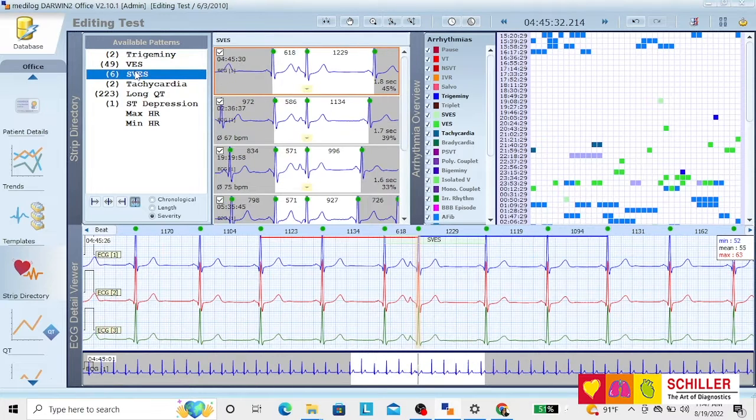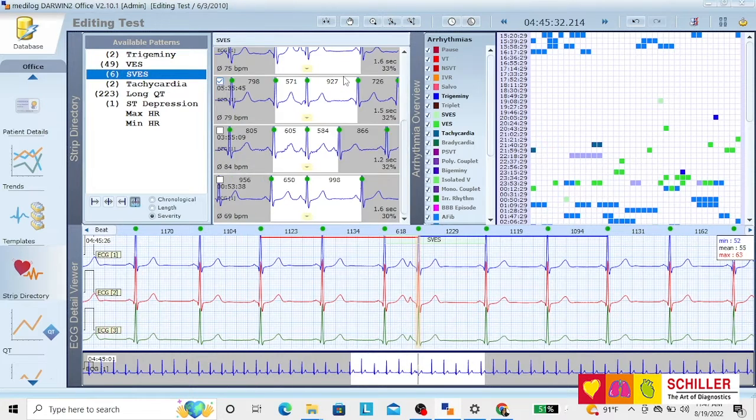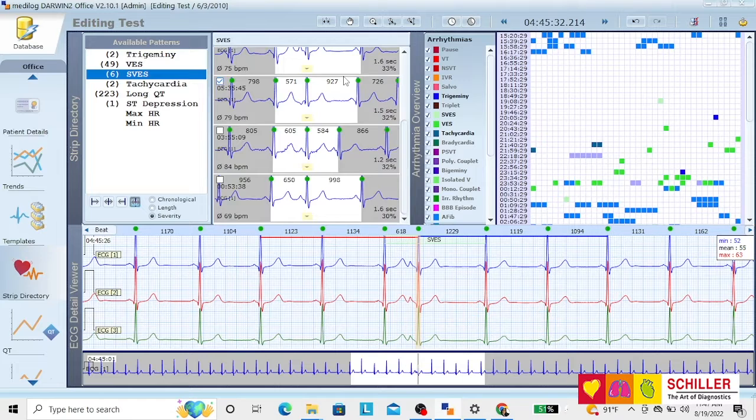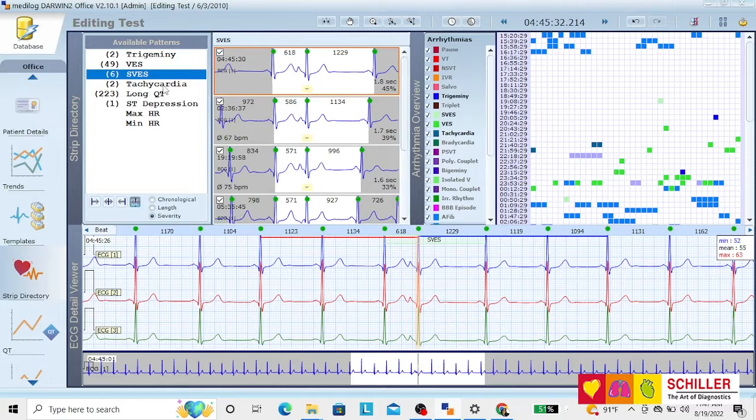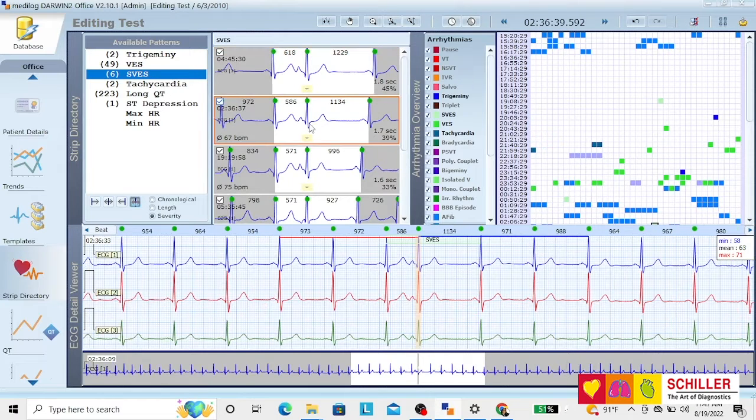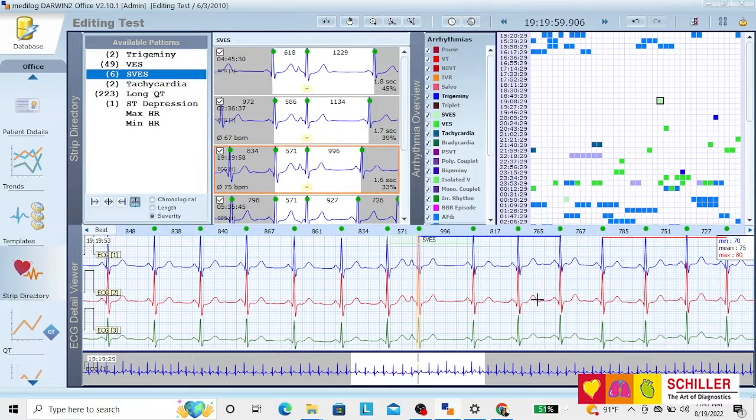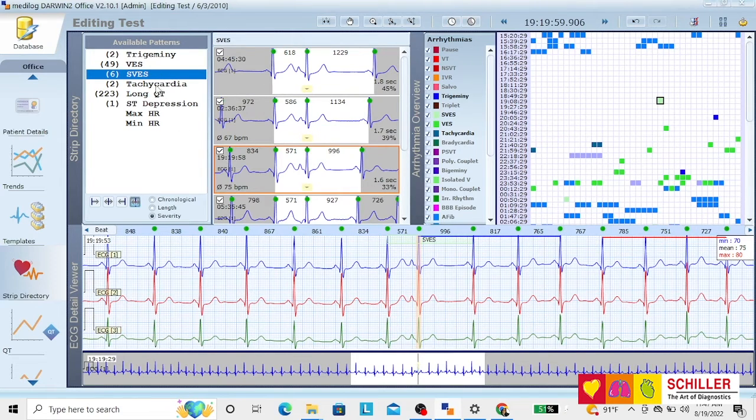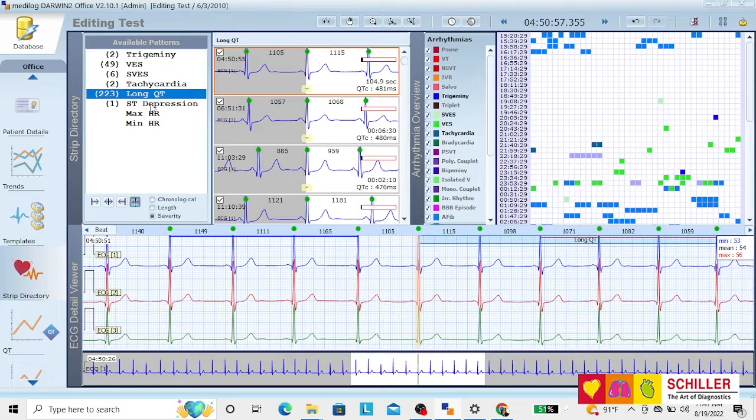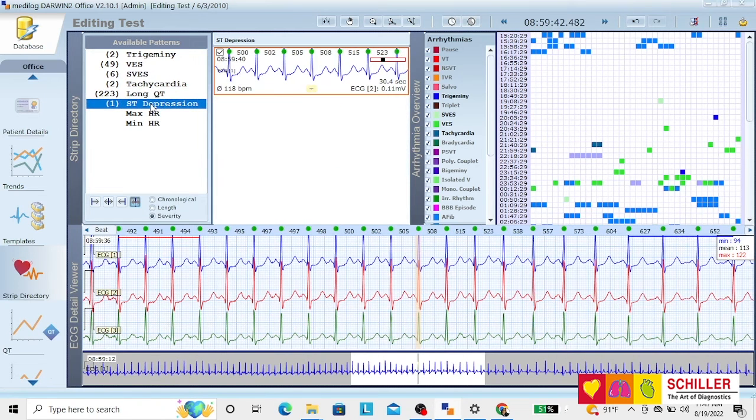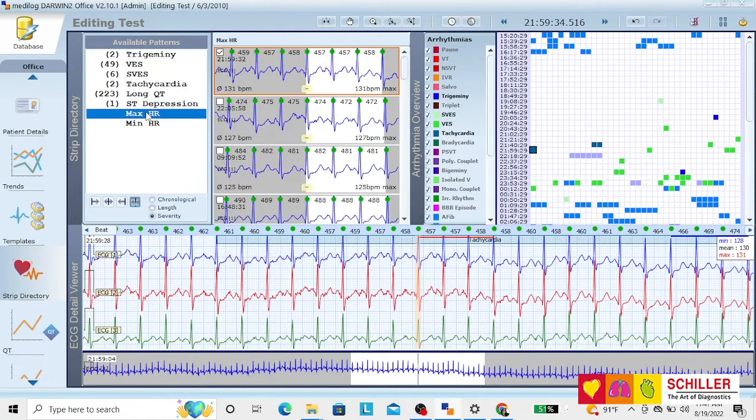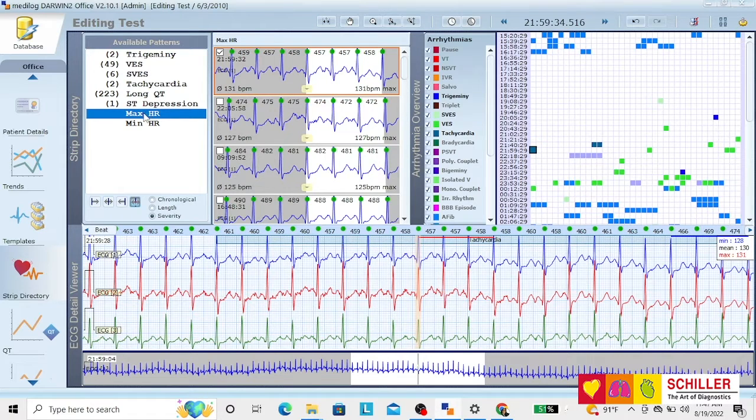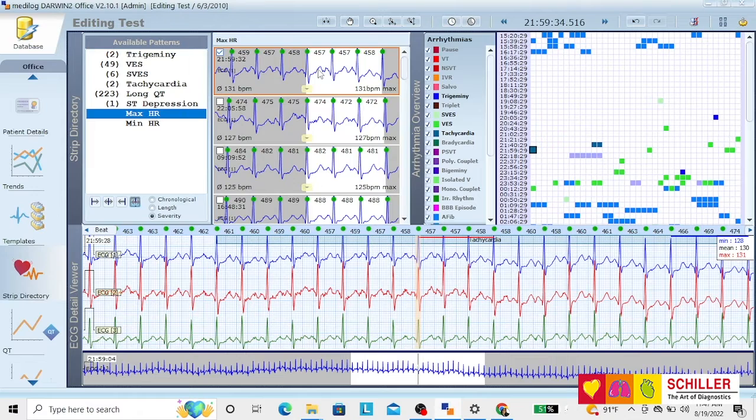You can drag down and see if they are correct. If you click on whatever strip, you will have the big strip down. Two periods of tachycardia, long QT, one ST, three periods of tachycardia. When you get to maximum and minimum heart rate, you need to make sure that the automatic systems have been correct, that it's not noise.